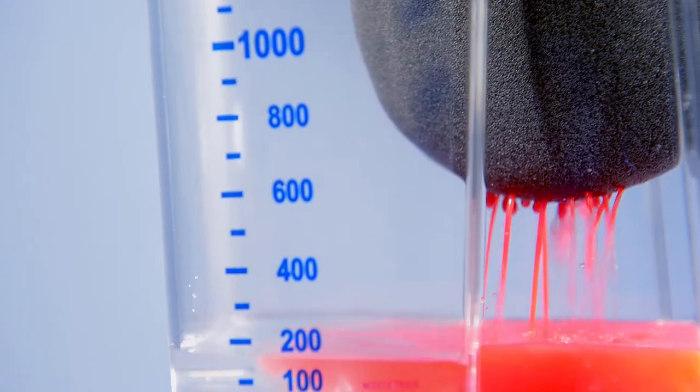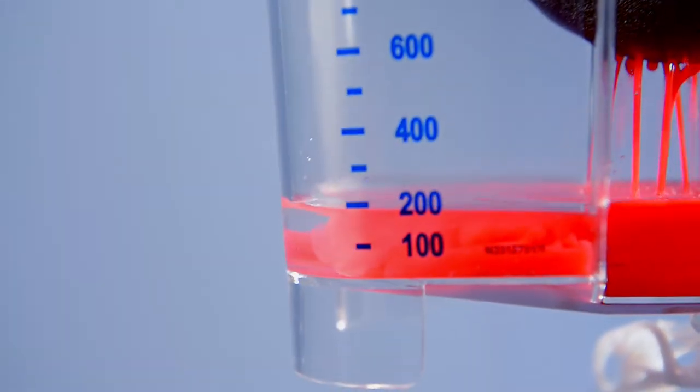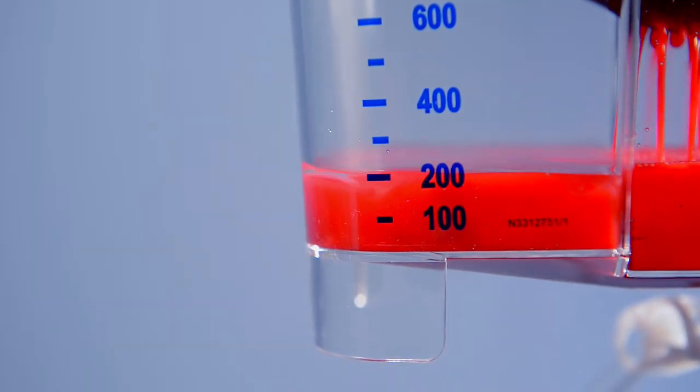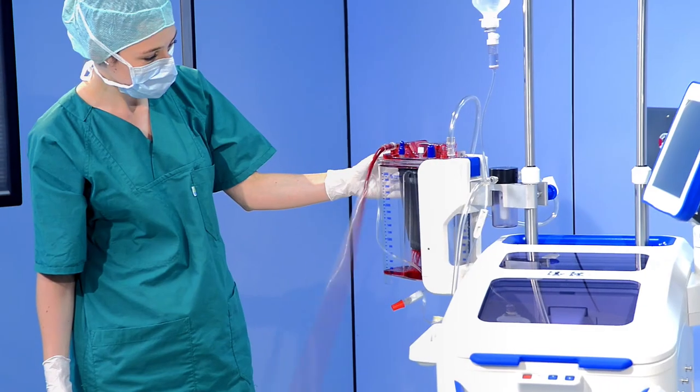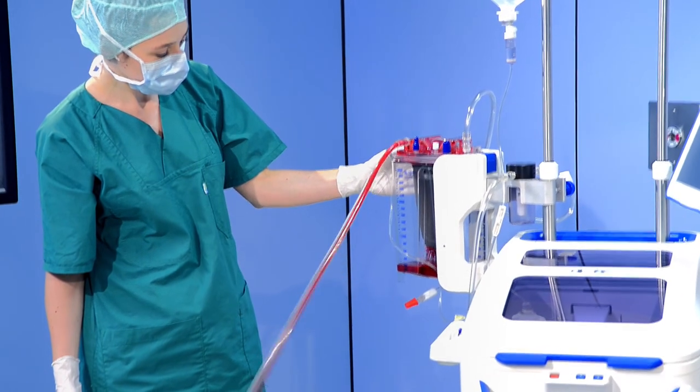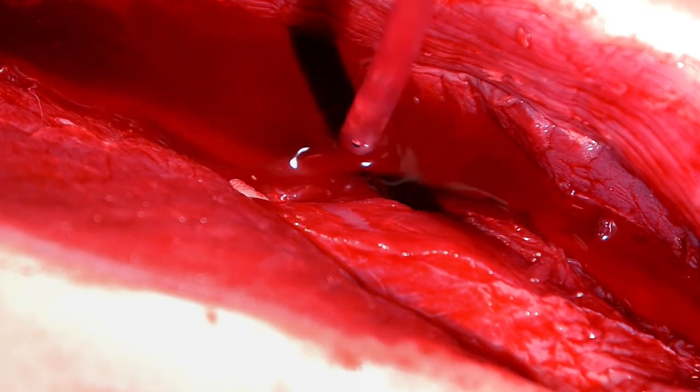Monitor how blood is being aspirated from the wound to the reservoir. Aspiration of too much air in the suction tip can activate clotting and causes hemolysis. Please keep in mind that red cells are very sensitive to shear forces.